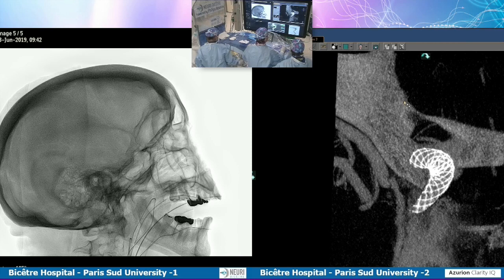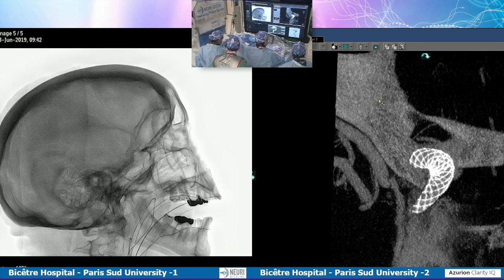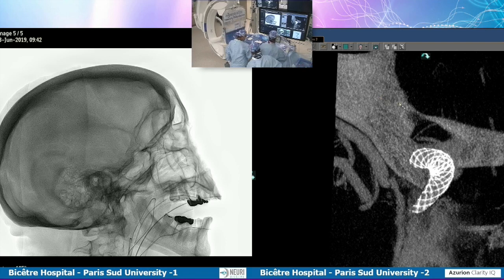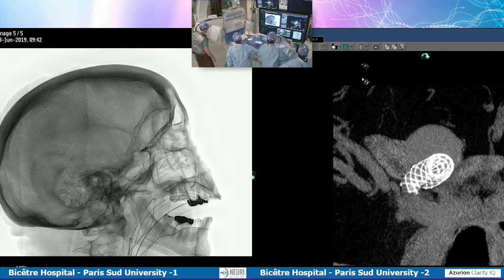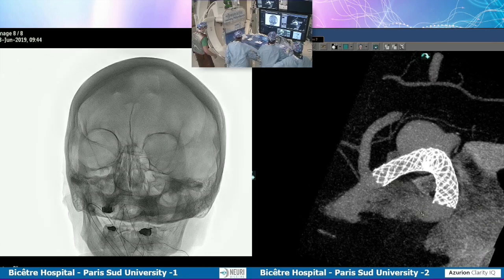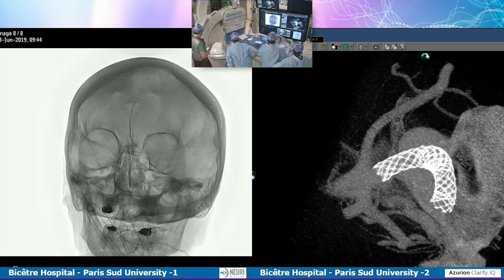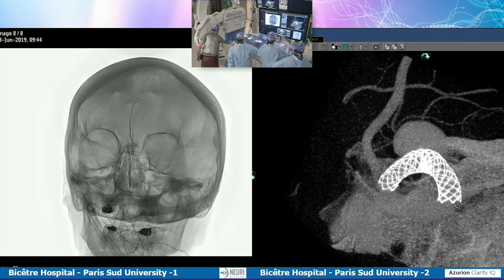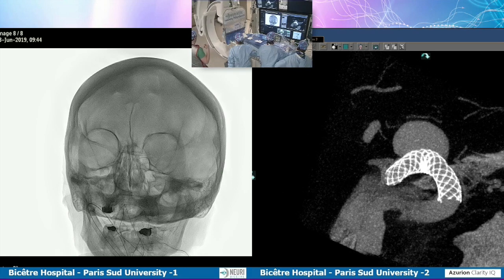Well, I mean, that's an interesting point. The problem, though, is that this can also occur in aneurysms that are treated with surgical flow diversion, say a bypass and distal occlusion or proximal occlusion. The reason you talk about it more is because you've done a lot more flow diversions for giant aneurysms. As it turns out, we just published a paper of 5 cases from multiple centers. It does happen. I think the physiology of a large aneurysm rupturing after you disturb flow in it or you divert flow around it is the same. It's not an inherent property of the stent. It's just a problem of changing the flow in it. So it happens either way. So with these large aneurysms, you either have to completely interrupt the flow in them or that risk exists no matter what you do.